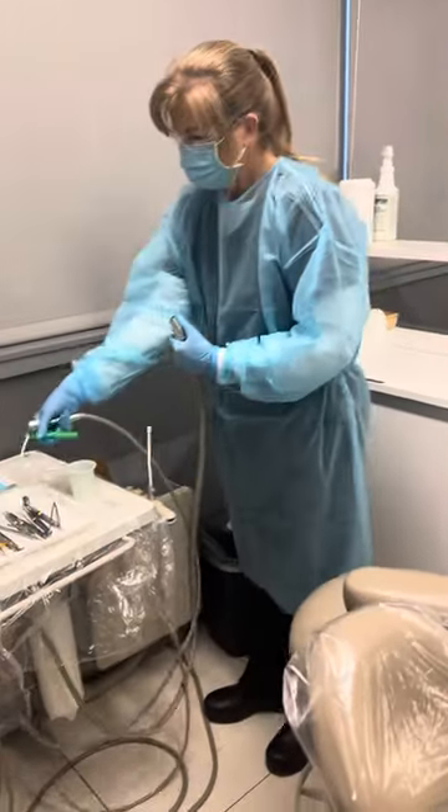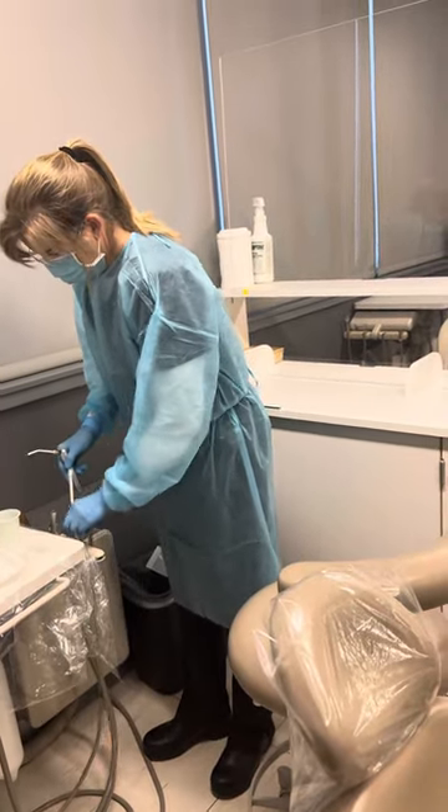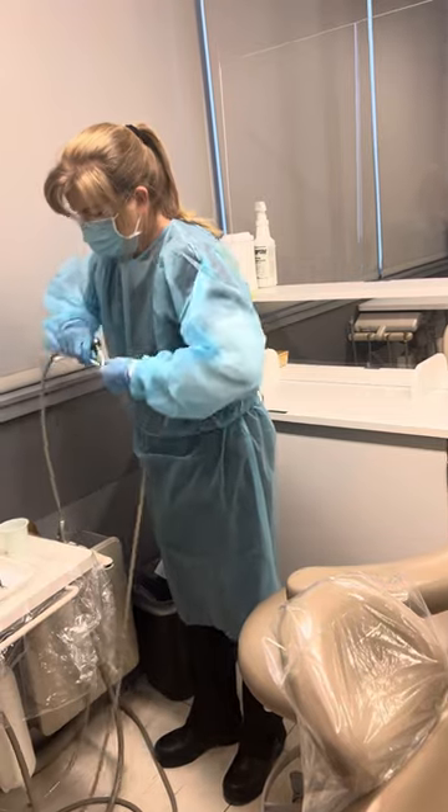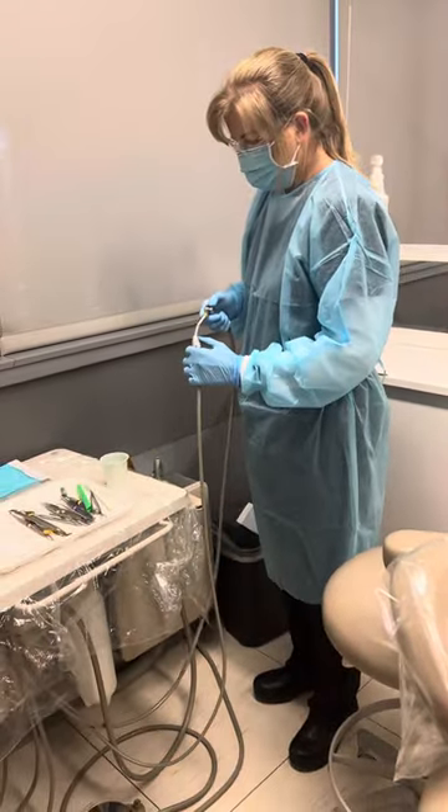Remember this is 20 seconds she's going to run. Then we'll take that tip off so we know that's done. She's going to pull off her saliva ejector — you have to take it off to be able to run the water — and she's going to run this line for 20 seconds as well.